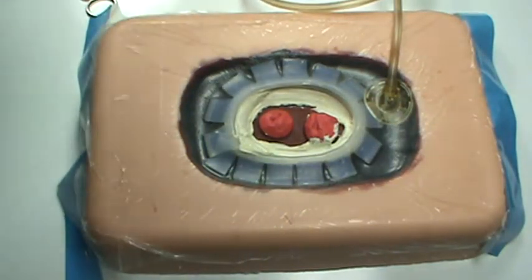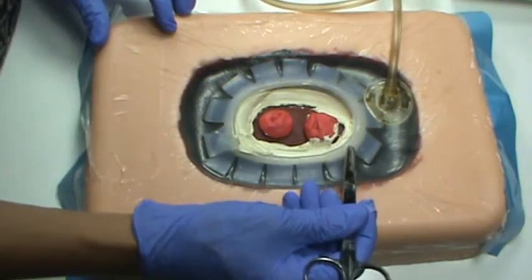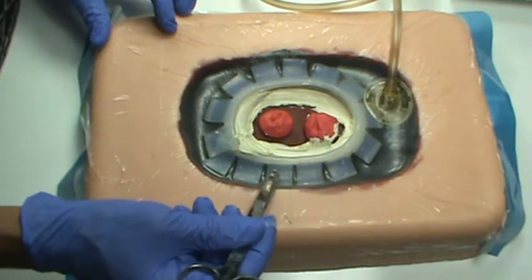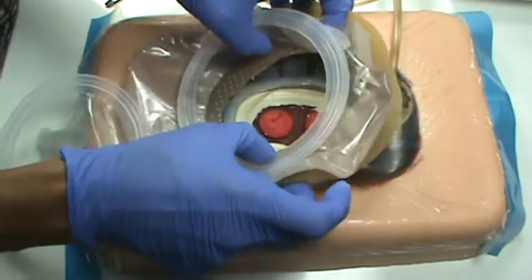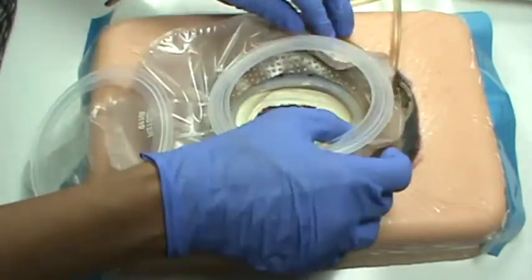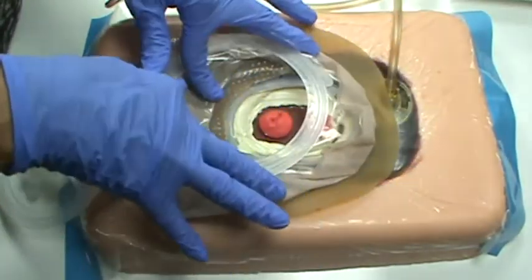Once you have your seal, a pouching system can be applied. When you're placing your pouching system, don't try and have the edge sit too close to the edge of the isolator strip. You really want it to sit back here. So I pretty much overcut the size so that it sits really to the outside of that strip. Just like that.